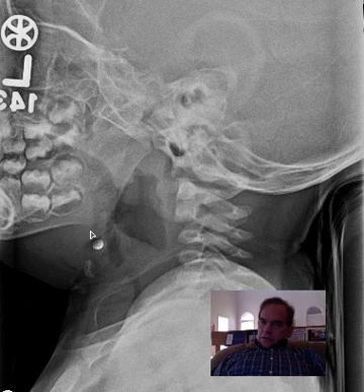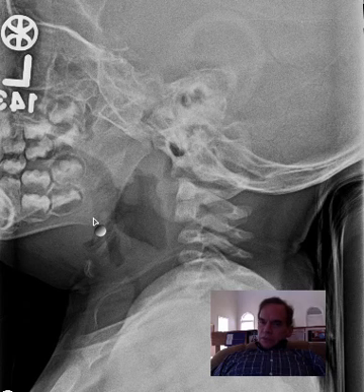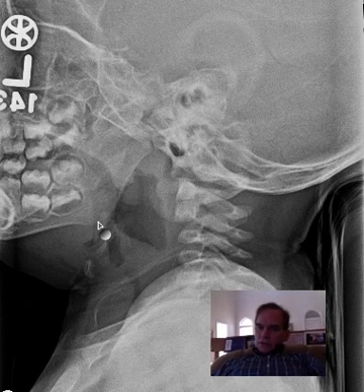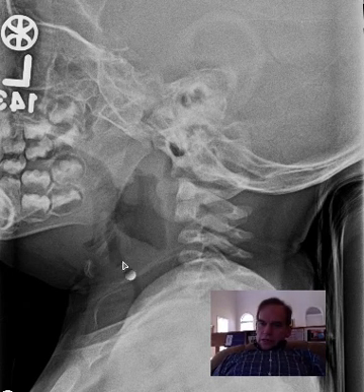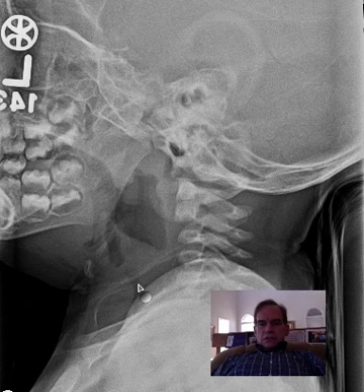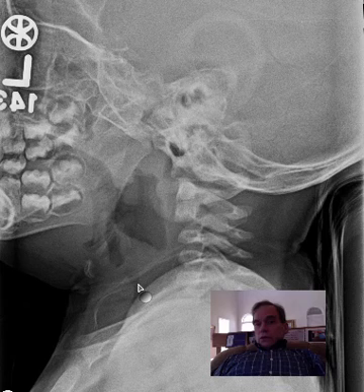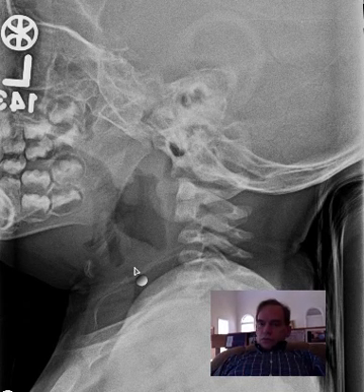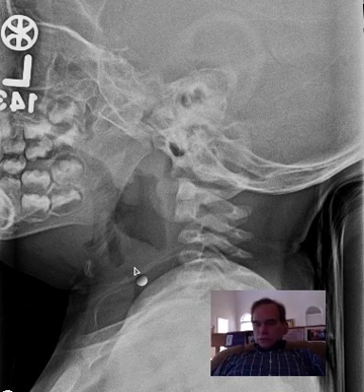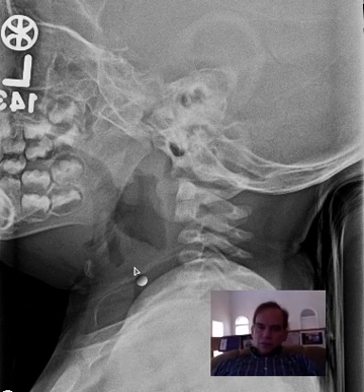Here you have the epiglottis and the aryepiglottic folds, and this is the back of the tongue back here. The epiglottis flips up against the back of the tongue or nearly so. Right here you see it all looks gray and that's because it's narrowed. We're looking at it from the lateral view, but in the AP view it's very visibly narrowed in terms of its actual diameter.